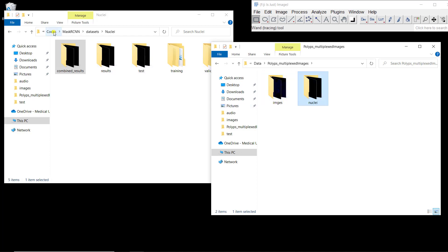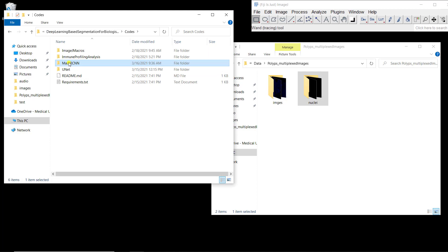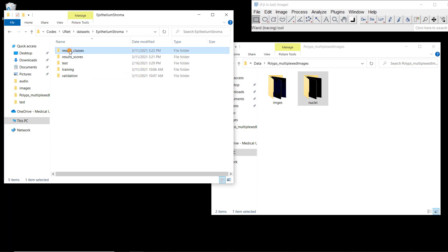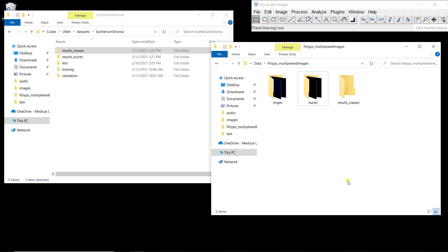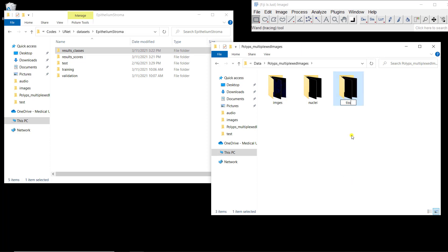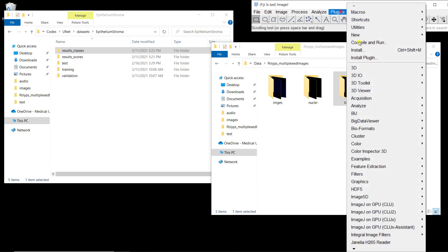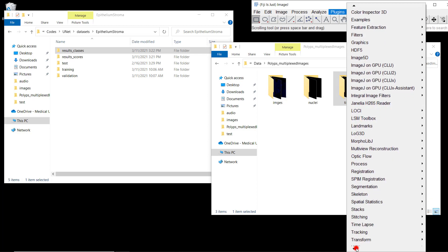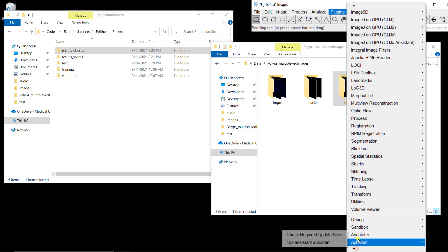I'm going to also copy the epithelium and stroma segmentation, which is in UNet, datasets, epithelium stroma, results classes. I'll copy and paste it here and rename it 'tissue'. Now I'm going to open Annotator — go to Plugins, then Annotator.